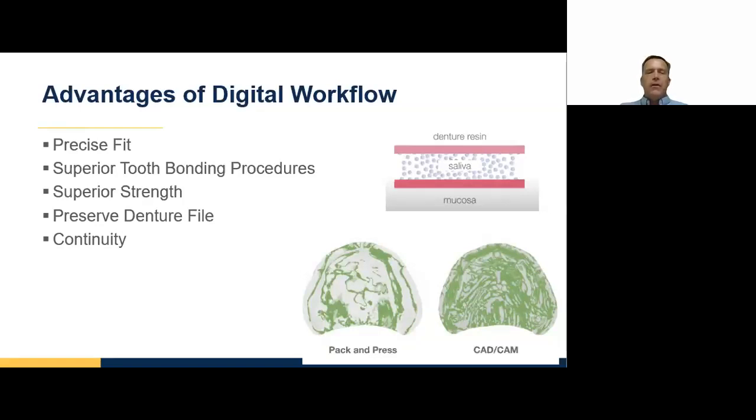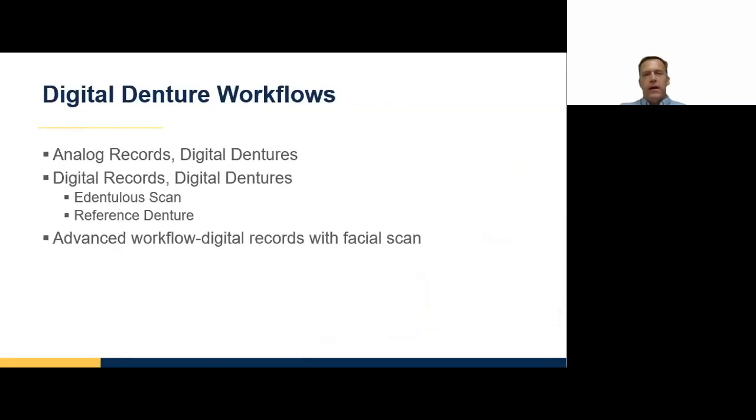One other thing I found in talking to dentists about what they like about digital is that the workflow doesn't have as many ways it can go awry. So you find a little more continuity. I realize I gotta kind of move along here.